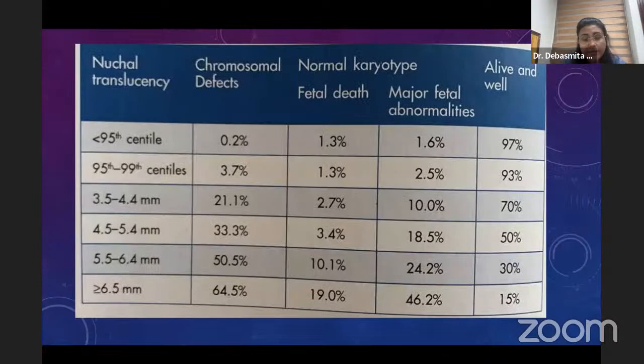And if we look into glycogen storage disease, we miss the ultrasound findings, because it happens in the late trimester or after the baby is born, when you tend to see all the anatomical problems or any kind of metabolic problems. So those are postnatal sufferings, and with the genetic test in the postnatal baby, we get to the diagnosis. So prenatally we usually go by a previously diagnosed glycogen storage disease, because we are not able to diagnose it in the current pregnancy. So we have preferred chorionic villi biopsy in those cases. I'll show you my list, what are the things we have done actually.